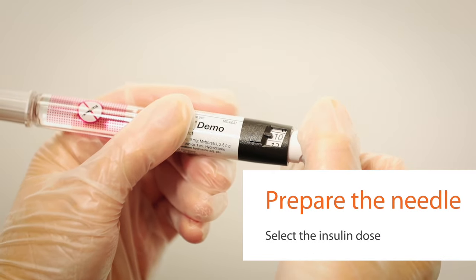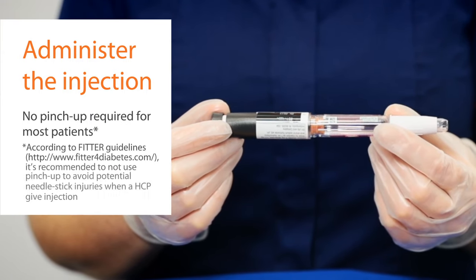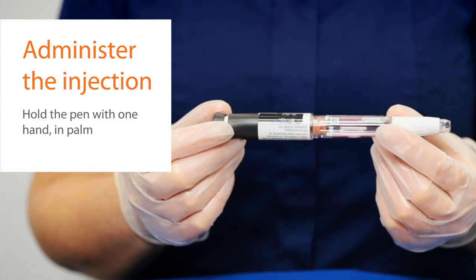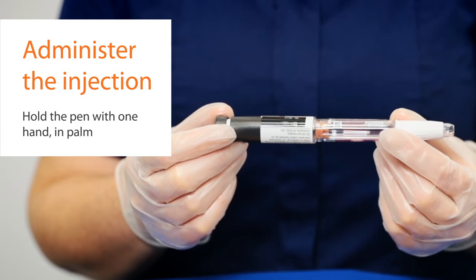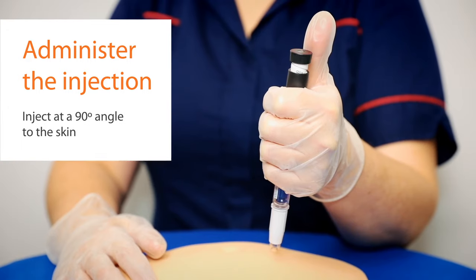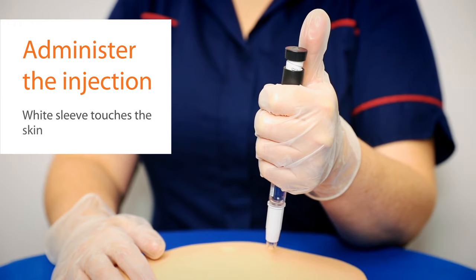Now administer the injection. Most patients do not require a pinch-up with a five millimeter needle. Palm grip the pen — do not hold it like a syringe and do not put your thumb on the button yet. Inject at a 90 degree angle to the skin, inserting the needle in one continuous motion until the white sleeve is flushed with the skin.